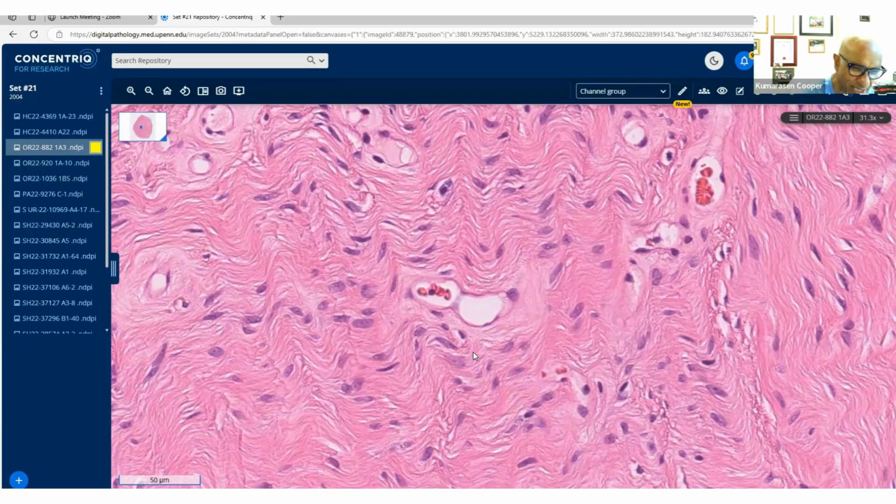But more often than not, you need a panel of immunohistochemistry. And we talked about that already. Just think of your myofibroblastic, your fibroblastic, nerve sheath, and that will give you guidance with respect to how to proceed. And don't forget the perineurioma, because that often is forgotten as a nerve sheath tumor. There are three nerve sheath tumors, and they can be hybrid as well. So it's neat to pick up some of the hybrid features as well.